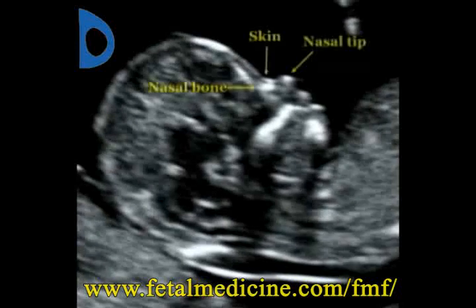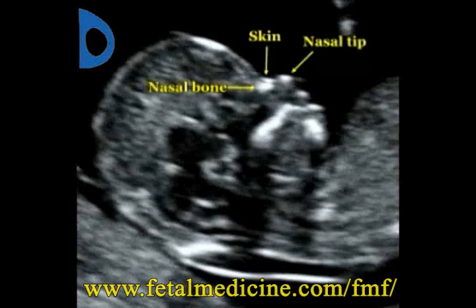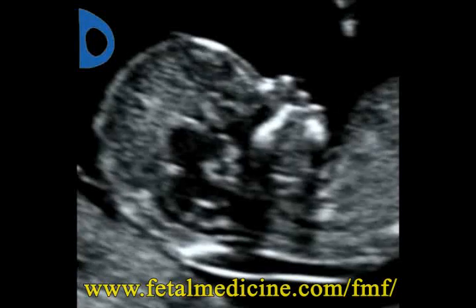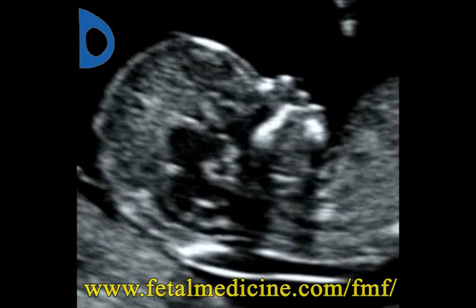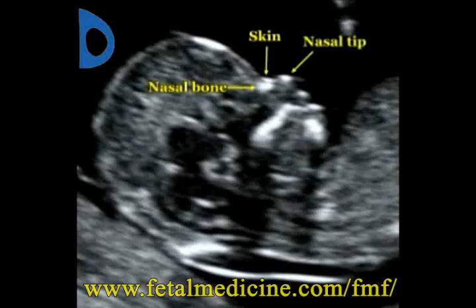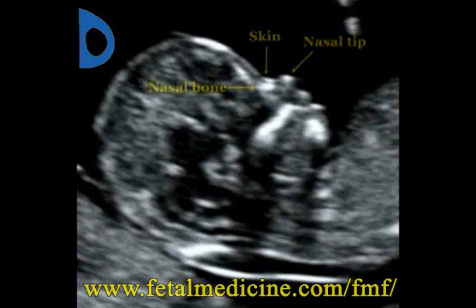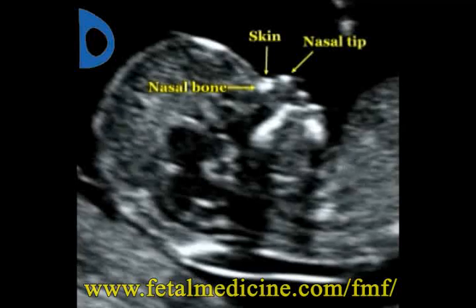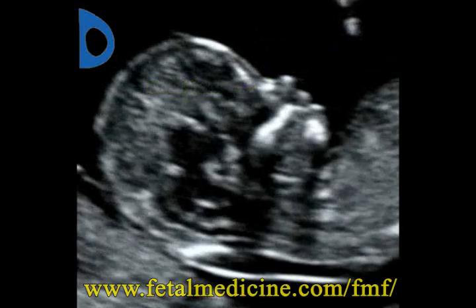The top line represents the skin. The bottom line, which is thicker and more bright than the overlying skin, represents the nasal bone. A third line, in front of the bone and at a higher level than the skin, represents the tip of the nose.